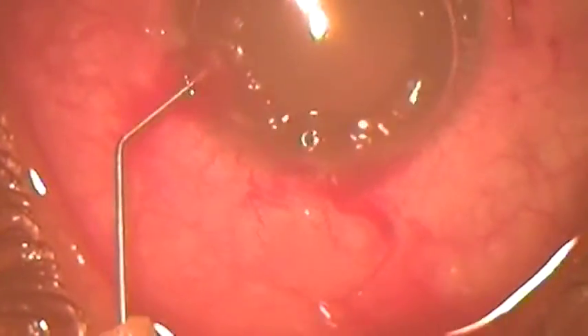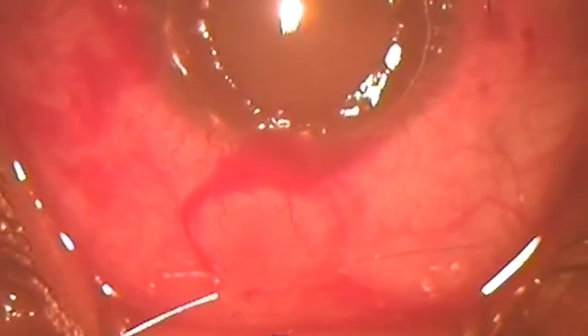A side port incision is made to push air into the anterior chamber, and one suture is placed to the conjunctival hole. I use 40-micron stainless steel.